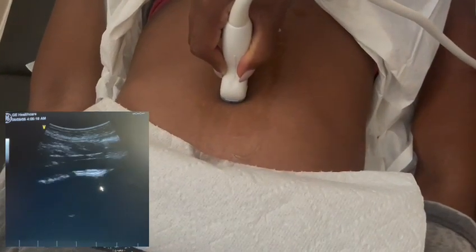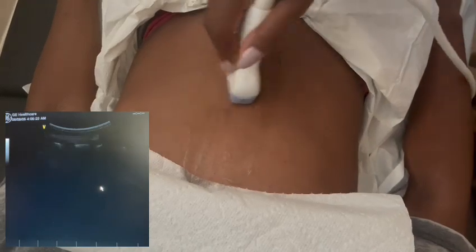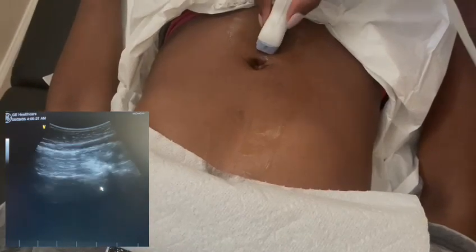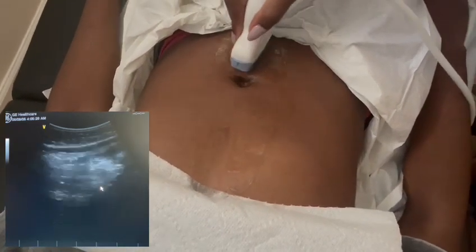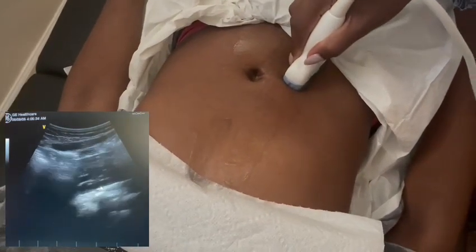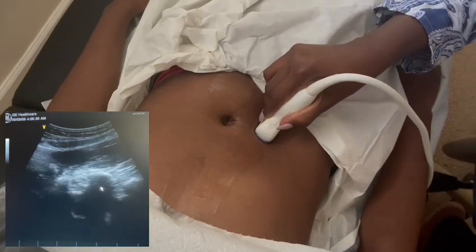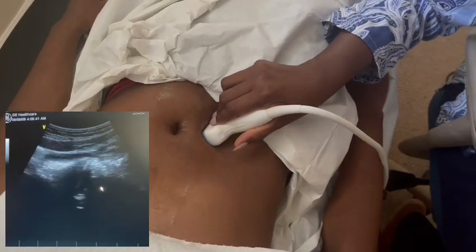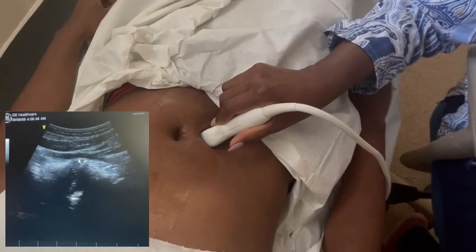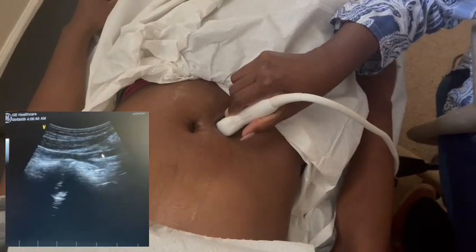Following that aorta down, fixing my gain as I come down again. The trick to the iliacs that I always use — and this works for patients with different body types, not just tiny or bigger patients, but all patients — is coming all the way to the right side. I'm looking for the right iliac, so I'm going to give it a push and angle towards the midline. I'm running right into that iliac — you can see it right there: common iliac artery, internal iliac artery, and external iliac artery.